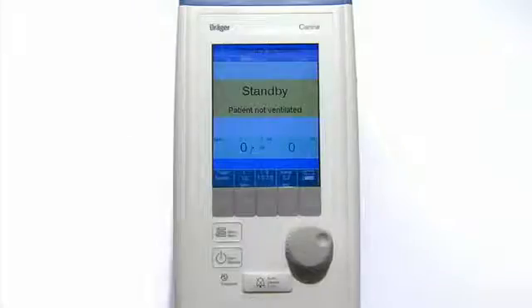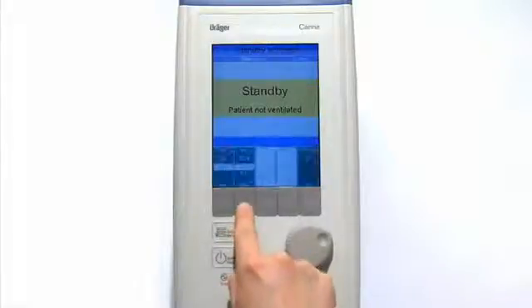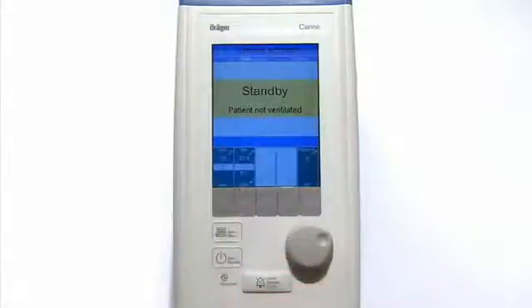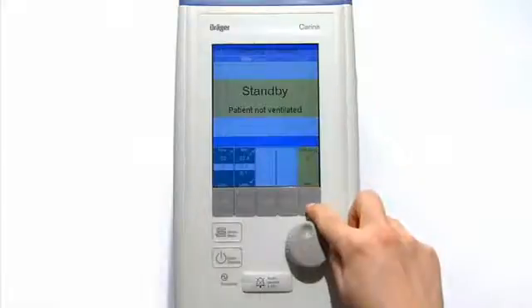To set the alarm limits, please press the button, select menu, then press the button alarms and set the alarm limits. Airway pressure high to 20 mbar. T disconnect, 0 seconds.